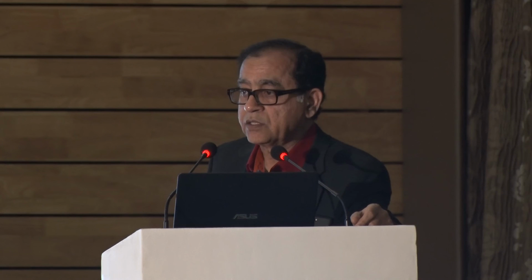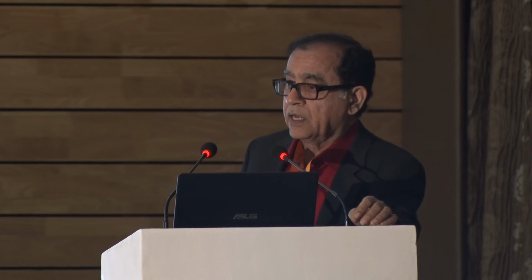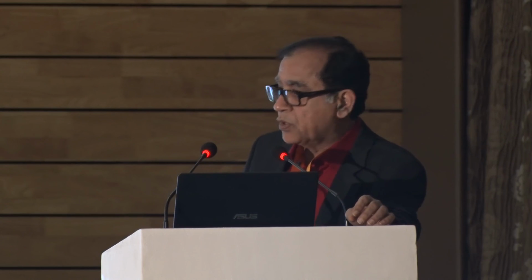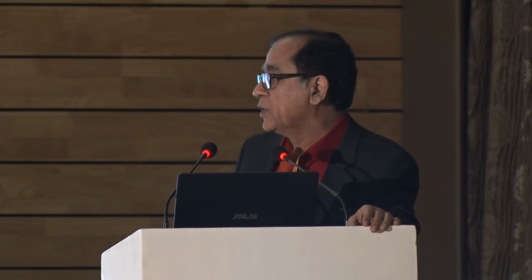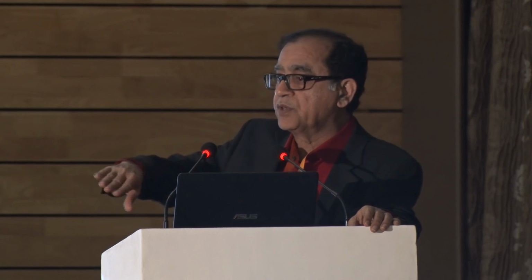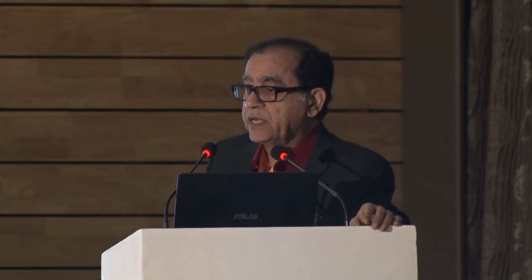So now look at this. I place the lens into the AC. I do not dial it into the bag, and then I just pull the loop, and in the desired axis I guide it into the rhexis, because in the presence of the vitreous I don't want to rotate the lens. I put the lens into the chamber in front of the iris, pull the loop and guide it into the bag. On both sides, you might have to use 2 instruments.